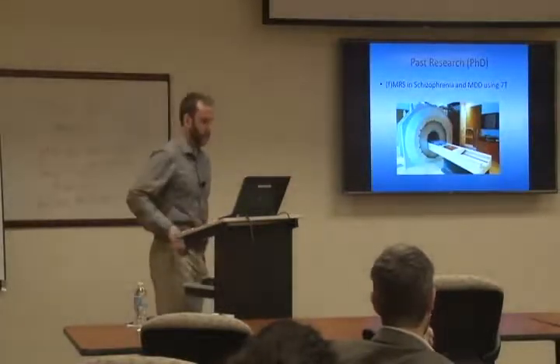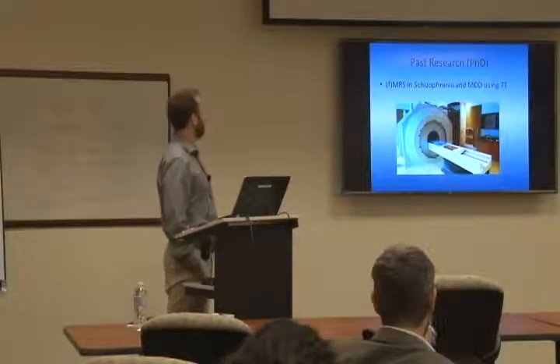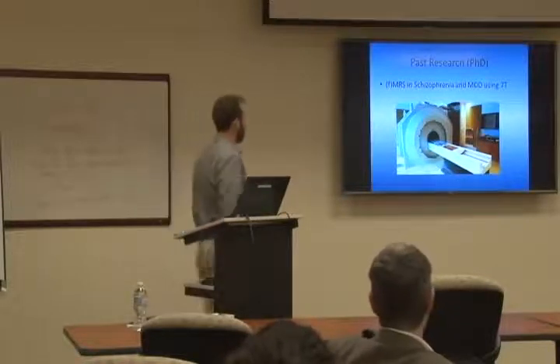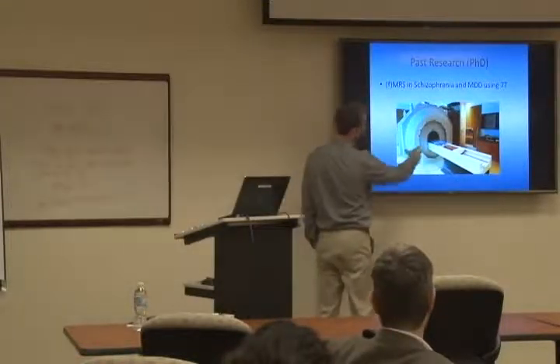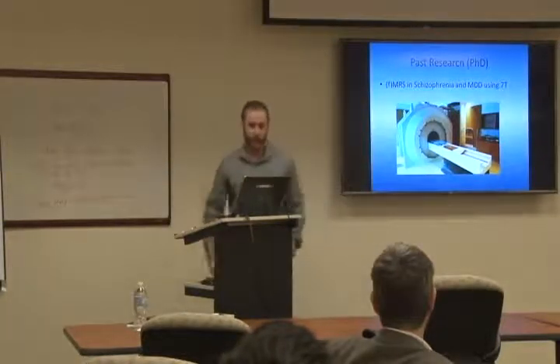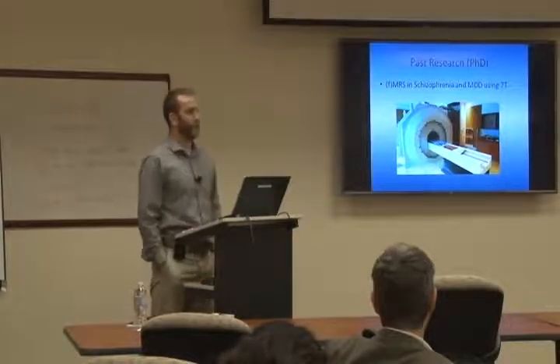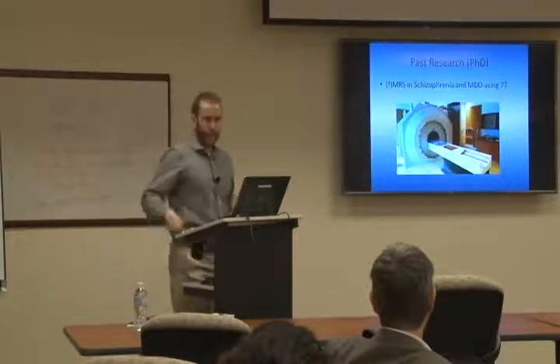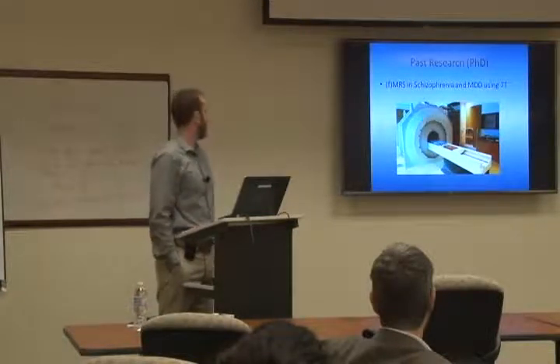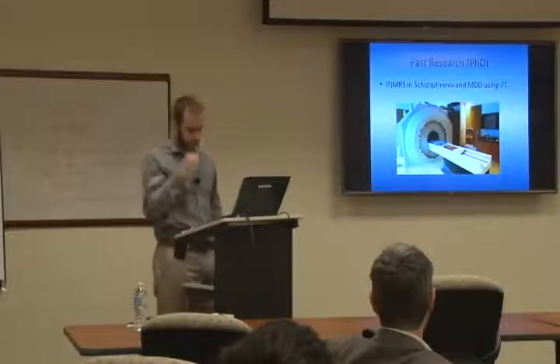This is the scanner that we used. It's a 7 Tesla head-only system, so you can see they actually dug into the ground here. It's actually a lot bigger than it looks, because they elevated it a little bit. That was entirely so the volunteers wouldn't feel as intimidated, because they were going to have to be raised up a long way and then put into the scanner. So just to make it a little easier on them, they raised up the platform there.